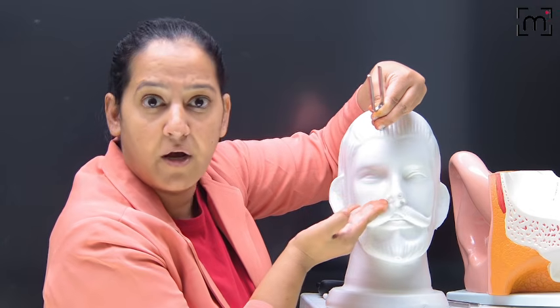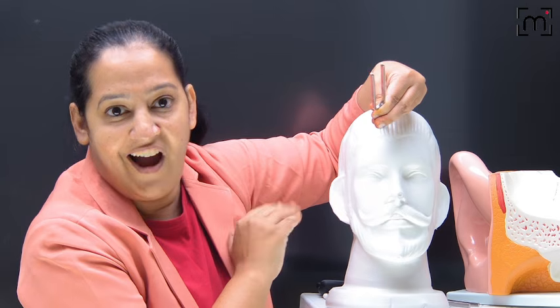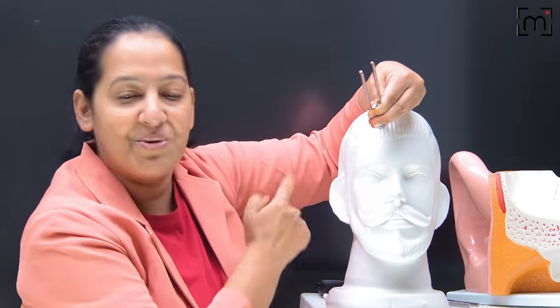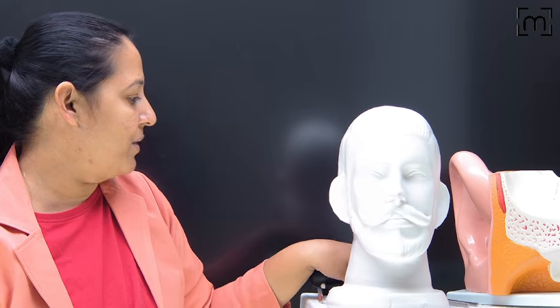The patient will be in shock. Ma'am, I'm hearing better in my defective ear. I don't know why, but I'm feeling vibrations good in my defective ear. So it is lateralized towards the defective ear. So that is a summary of the Weber. I tried really hard, people. Okay, so that was the summary.